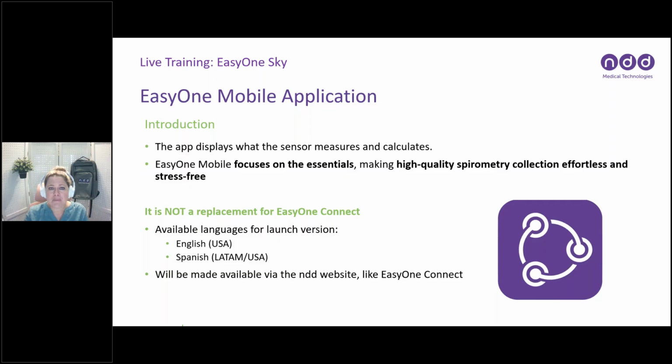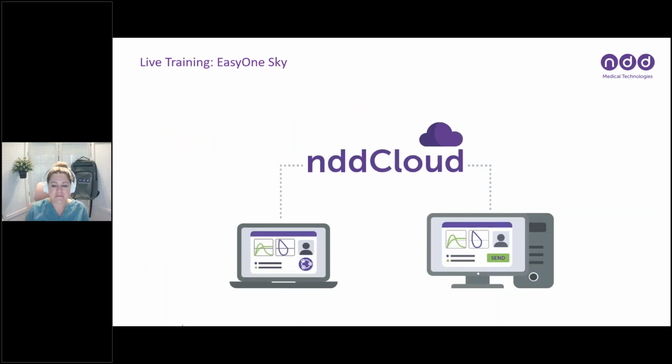As I said, this is not a direct replacement for EasyOne Connect. Right now, we only have 2 available languages, and that is English and Spanish. And the reason for that is right now, the EasyOne Sky is only available in the US market. It will shortly be expanding to a global audience, but right now we did focus on English and Spanish for the languages just because of where we did decide to make the launch. The EasyOne mobile application is available on our website to download, just like our EasyOne Connect software.